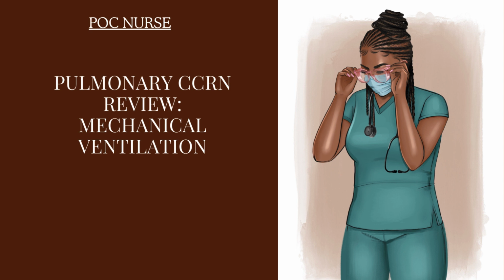Now the respiratory rate, tidal volume, the amount of air that they are pulling, the rate of air that they are pulling, the inspiratory time, all of this is determined by the patient's breathing effort. So the patient is doing the work of breathing on their own. So for pressure support ventilation, this is totally on the patient to breathe. So there will be no assist control mode in this case. The patient is breathing by themselves. Remember, in assist control mode, the breath could be triggered by the patient or the machine will just breathe for the patient.